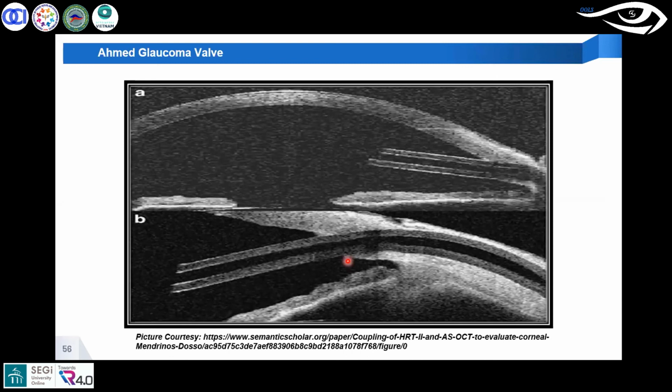So I'd like to conclude that basically, when you are going to look at a patient, you can never diagnose it completely by using only an AS-OCT procedure. You have to combine it with other procedures as well, like a slit lamp, or you can use other techniques for looking at the patient and then diagnose it to be a particular ocular condition. But in some cases, there would be situations where you will have a dilemma whether it is one conjunctival condition or another corneal condition. In those cases, you can actually make a differential diagnosis by using an AS-OCT.